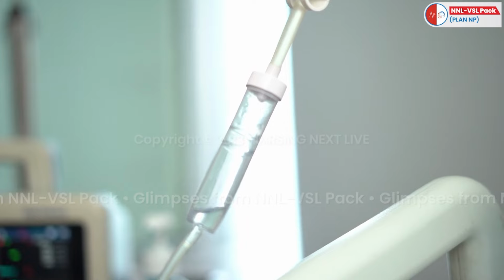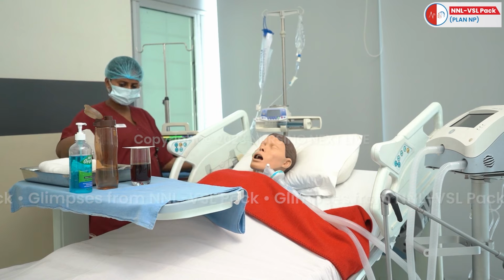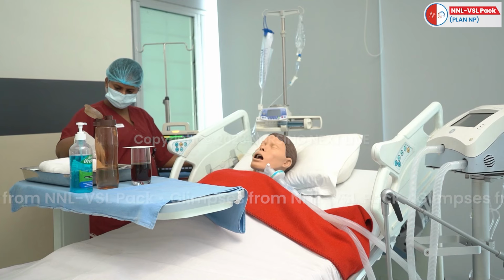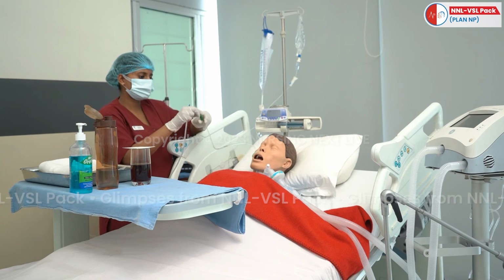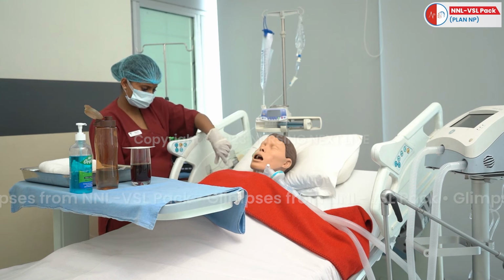Kink the nasogastric tube and connect the gravity bag to it. Pre-flush the nasogastric tube and leave around 5 ml of water in the gravity bag.